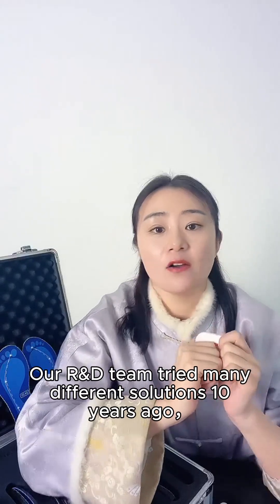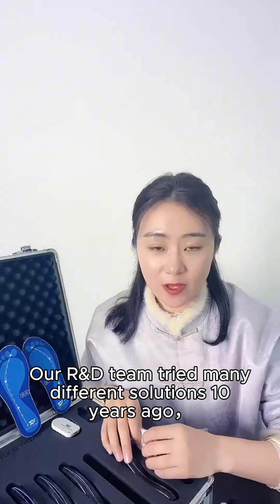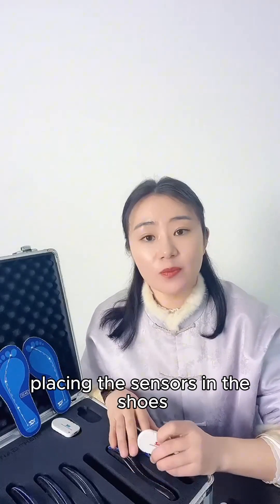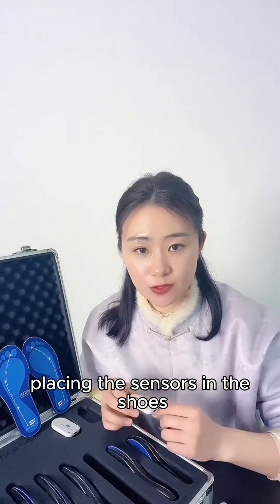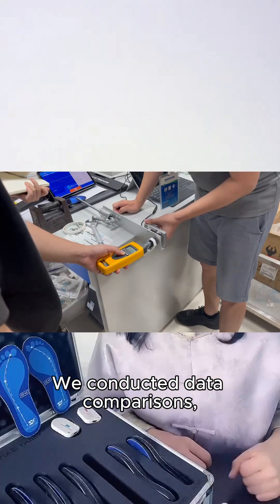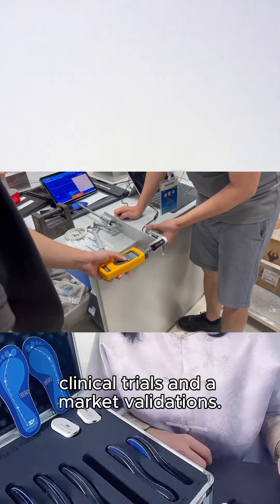What's more important is that our design truly enables medical-grade clinical applications. In fact, our R&D team tried many different solutions 10 years ago, including thin film insoles to measure plantar pressure, placing the sensors in the shoes, or attaching the sensors on the shoe surface. We conducted data comparisons, clinical trials, and market validations.